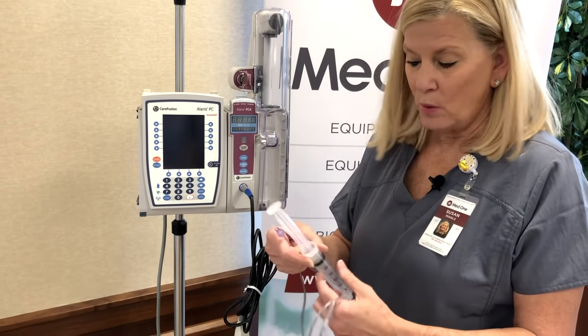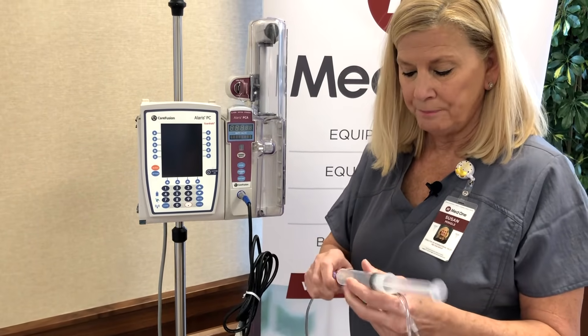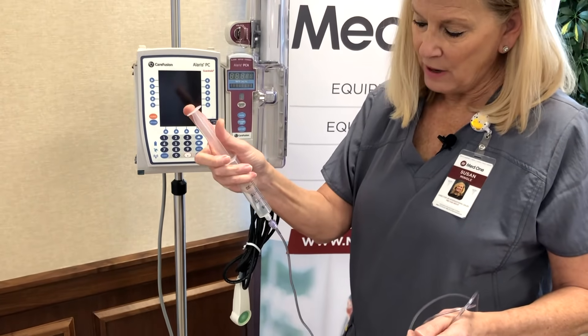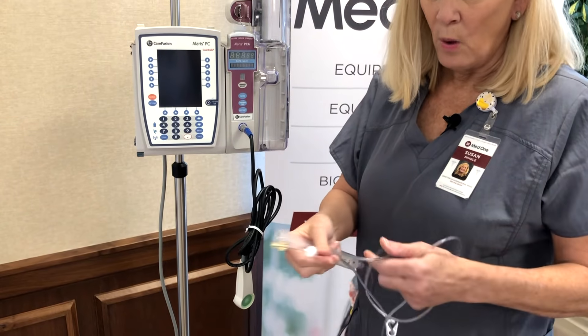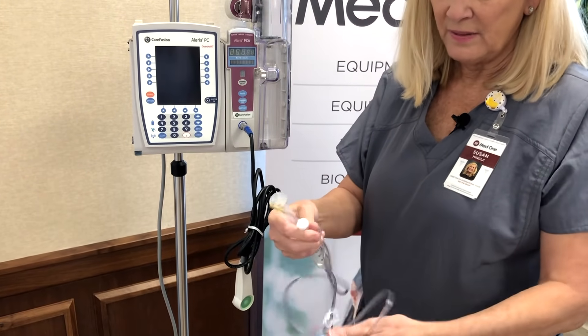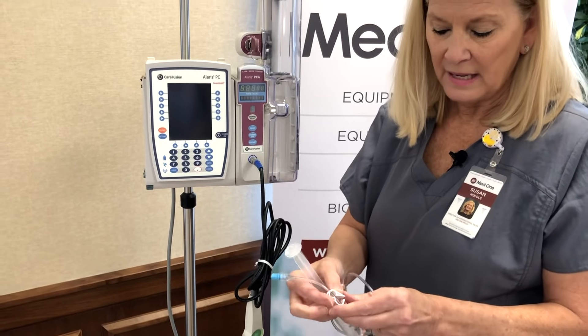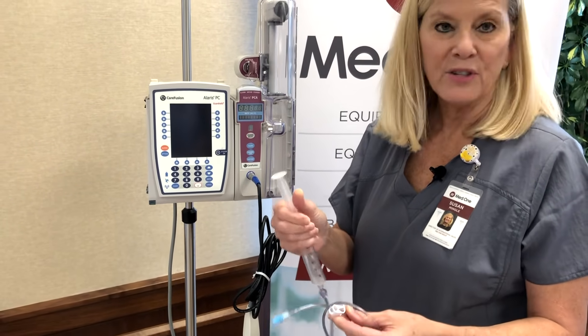Prior to starting, we want to go ahead and prime our tubing. With this pigtail set, make sure you've primed your tubing, then Y your carrier fluids through and attach it at the IV insertion site. We always recommend going ahead and clamping it off prior to starting.